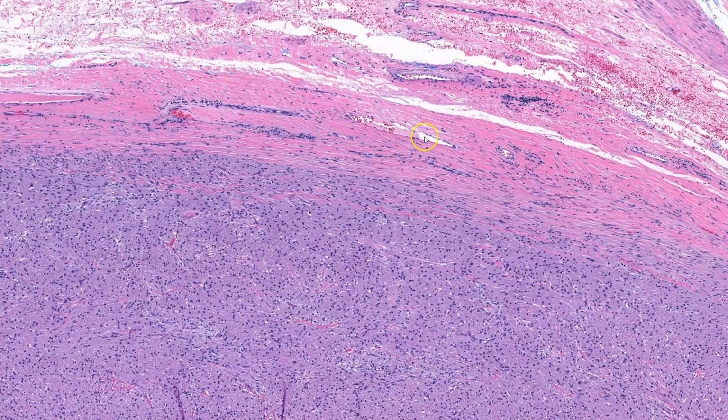Before I move on to the next case, I want to briefly mention non-neural granular cell tumor, in particular congenital granular cell epulis, which occurs on the anterior alveolar ridge of the oral mucosa in predominantly female newborns. Cells are indistinguishable from granular cell tumor, but do not stain with S100 and other neural markers. In addition, the overlying mucosa is atrophic, not hyperplastic. These tumors are always benign and often regress by the time the patient is a year old.